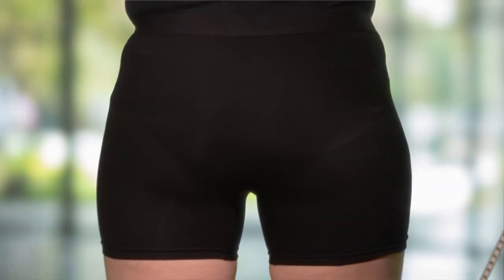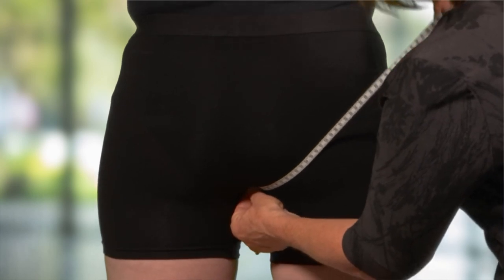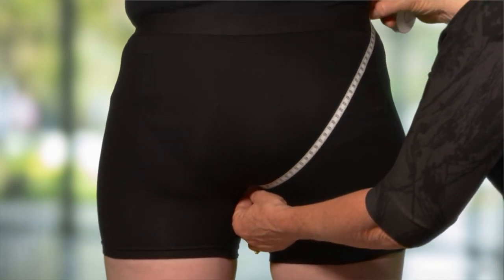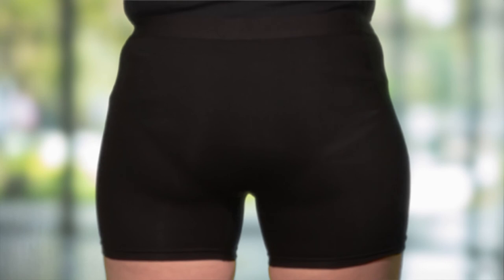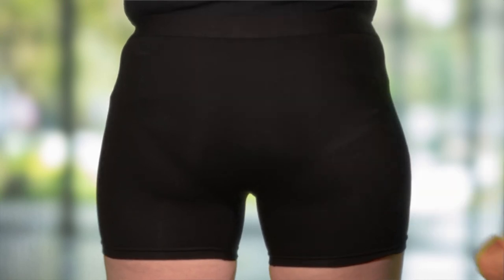The next measurement is a diagonal one taken from the anus across one buttock cheek to the iliac crest. The final measurement is a linear measurement from the gluteal fold to the top of the support, as marked for the initial measurement.